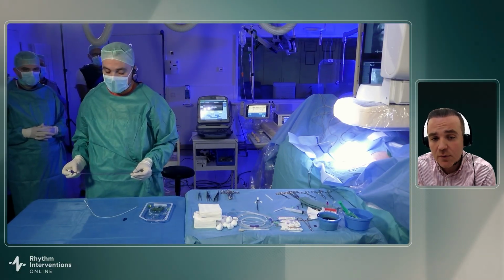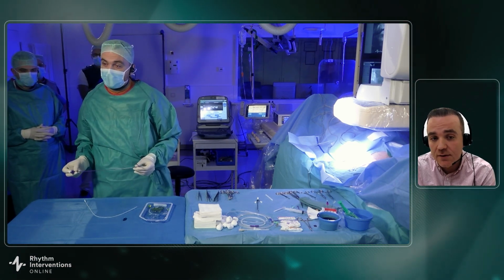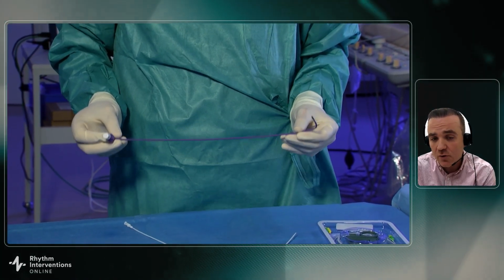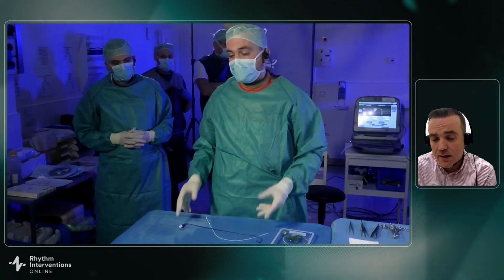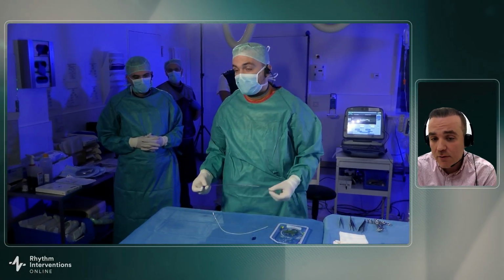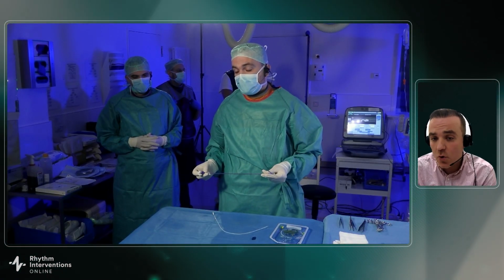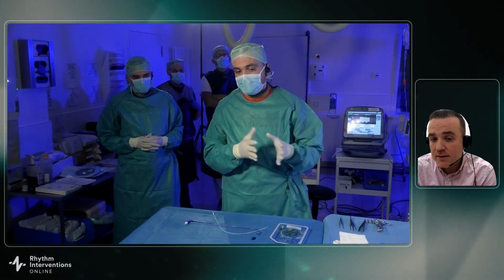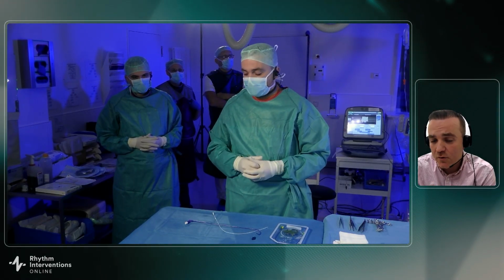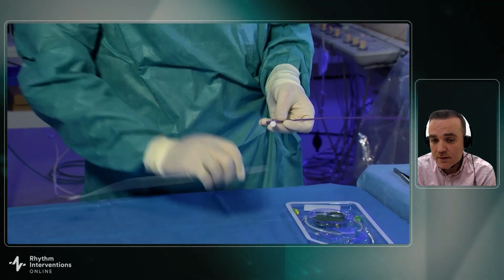We decided to perform the procedure with the material of Boston Scientific. And as you know, we have two options, two catheters, the SSPC 2 catheter and SSPC 3 catheter. It depends on the indication. If we have a patient with a heart failure indication, dilated LV, we're going to start with catheter number 3. If we have a patient with a not dilated LV and mildly reduced ejection fraction or normal systolic LV function, we can start with catheter number 2. Here in our case, the patient had an LV function of 48% and a left ventricular end diastolic diameter of 48 millimeters.